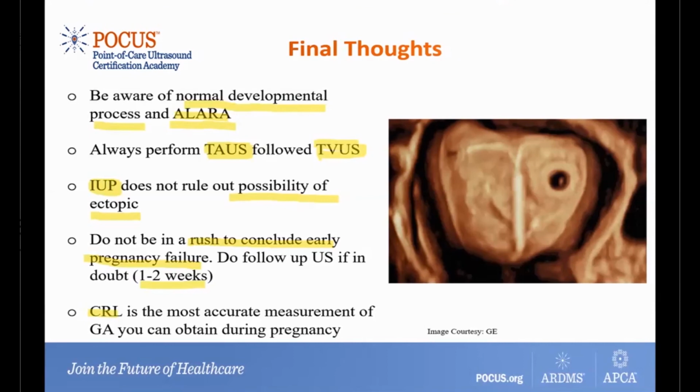If the gestational age does not correspond to the fetal parameters, then you will want to look at the old report that you obtained earlier in the first trimester. Based upon the gestational age that you, or someone else, obtained using the crown rump length, you can calculate the true gestational age from that point.